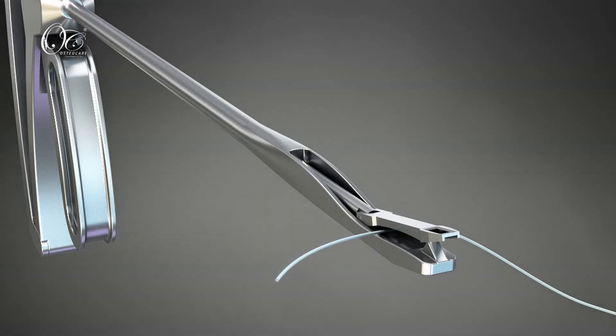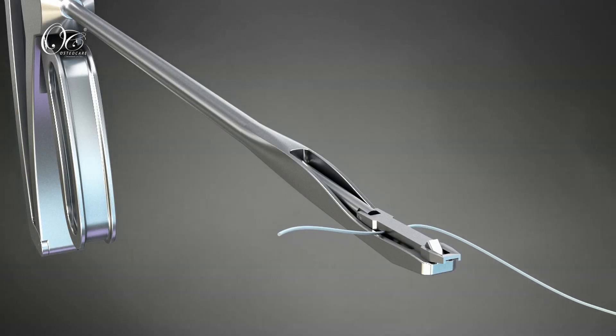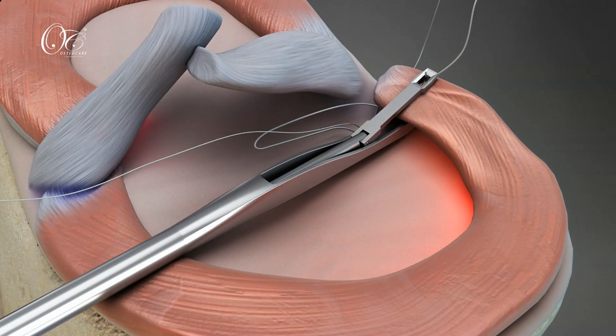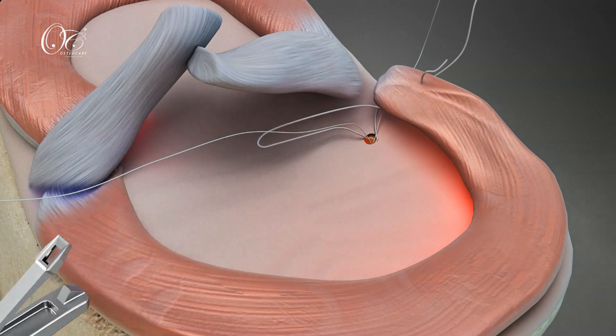Direct the first fiber strand with the suture passer through the detached meniscus. The accompanying fiber is then passed into the meniscus stump. The same step is repeated with the second fiber.